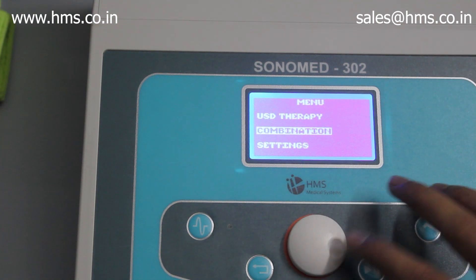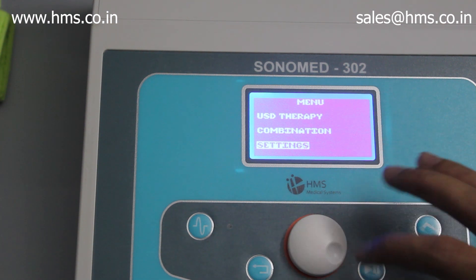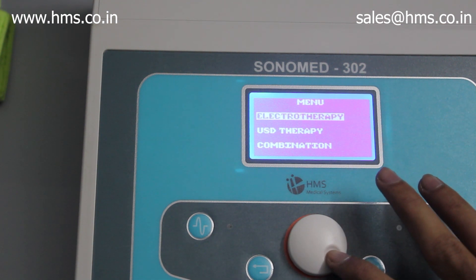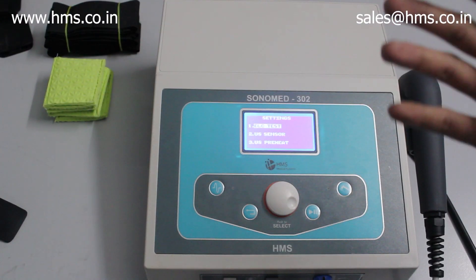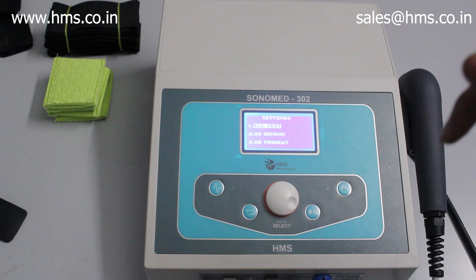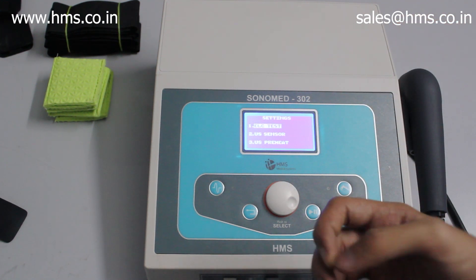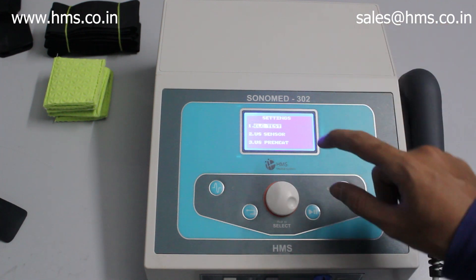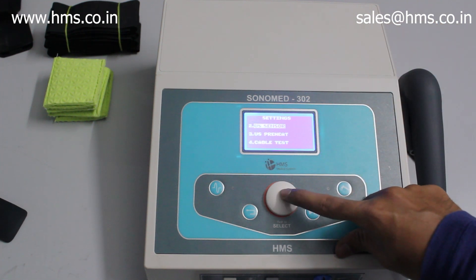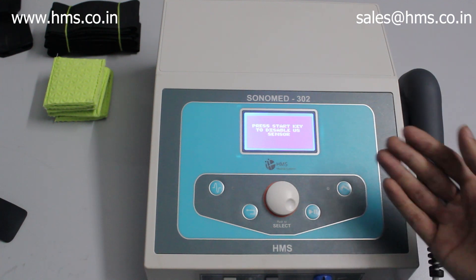You can also save your own settings as memory — there are 30 memory slots available. Within the settings menu there is a testing feature: under electrotherapy, the test feature lets you test the conductivity of your electrodes and cables. You also have the option to disable the US sensor if desired.